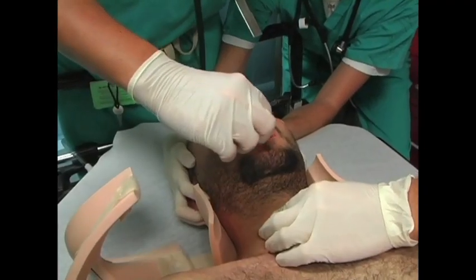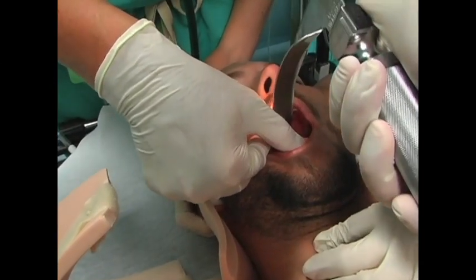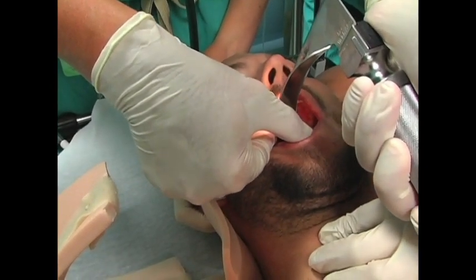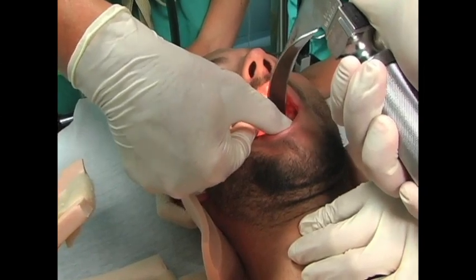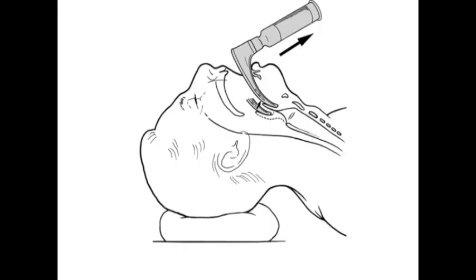We will now demonstrate utilization of the curved blade. The curved blade is introduced on the right side of the mouth, and the tongue is swept over to the left-hand side using the flange of the blade. The direction of the lift is along the axis of the laryngoscope handle. It is important to avoid levering the blade on the teeth to prevent dental trauma.